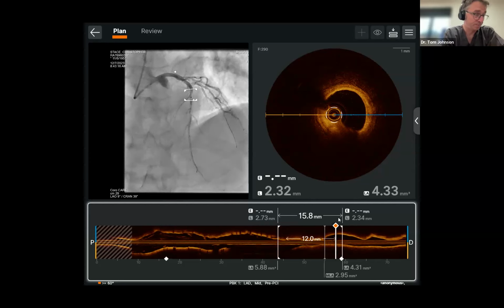Now, the other important thing to consider here is what are we seeing at this point, because this is quite a classical appearance of the catheter sitting eccentrically within the lumen, so sitting against the vessel wall. And actually what we probably have here is just blood that's hugging the catheter and wraps onto the luminal surface.